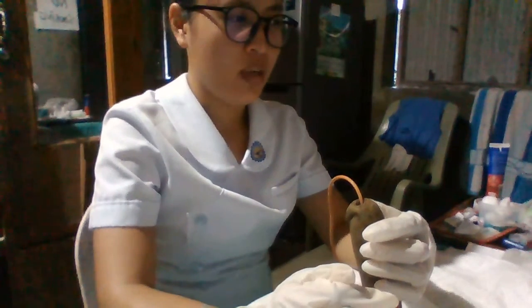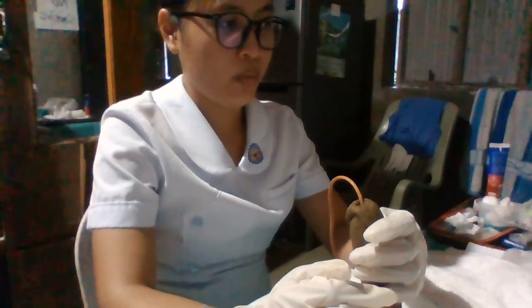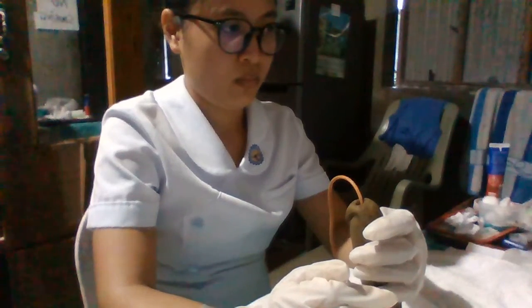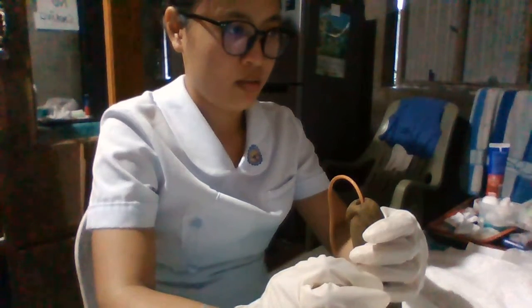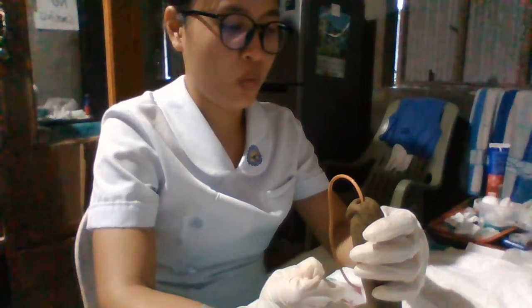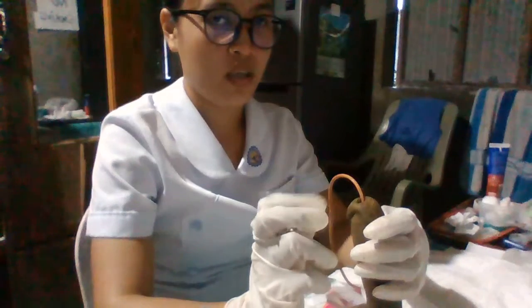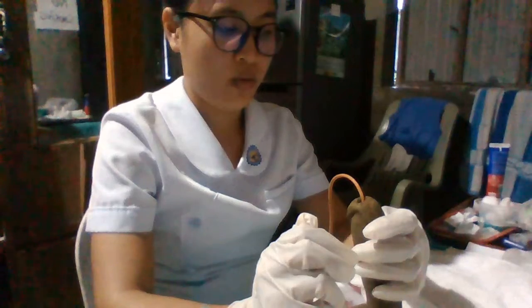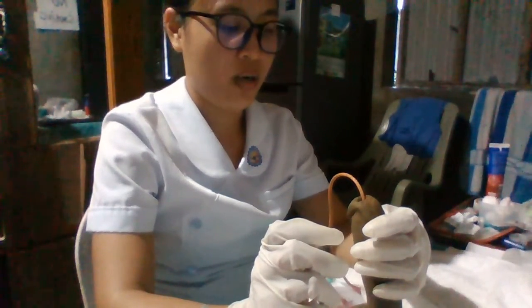Then hold the penis shaft and maintain our hands in the area, and then we are going to assess the urethral meatus and the surrounding tissue for inflammation, swelling, or discharge.